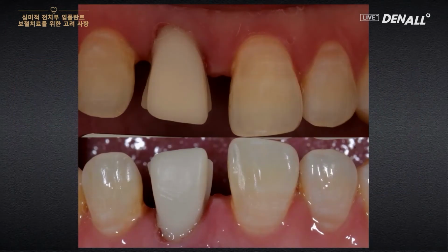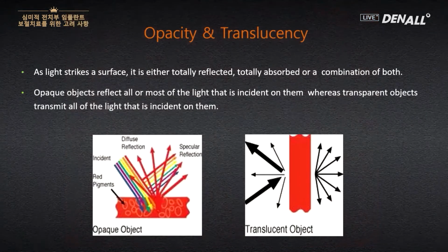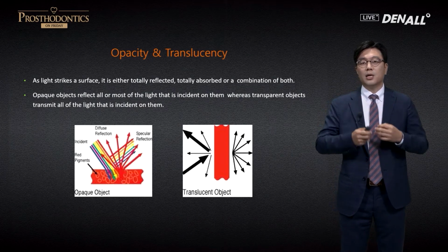Upper and lower are taken with the Polaroid film used for the upper picture. Final prosthesis is delivered, and that looks very similar to natural teeth. We need to be careful when we select a shade. The background is dark, so we need to consider that.